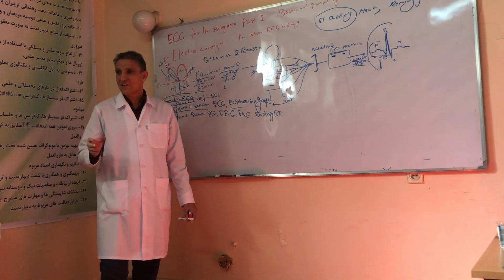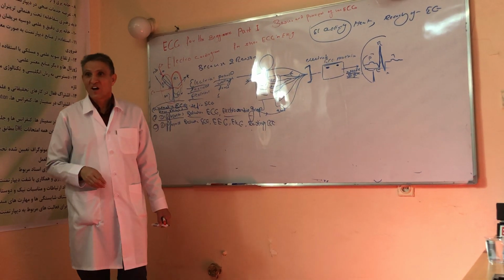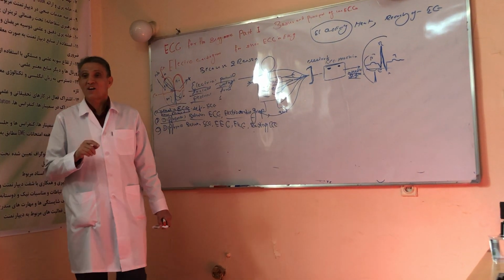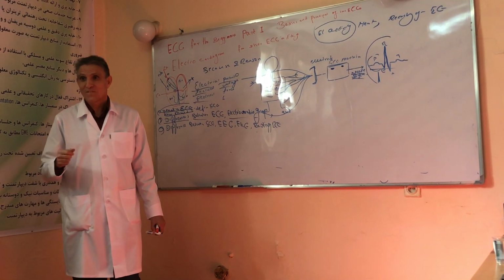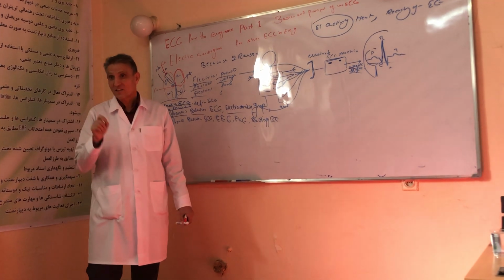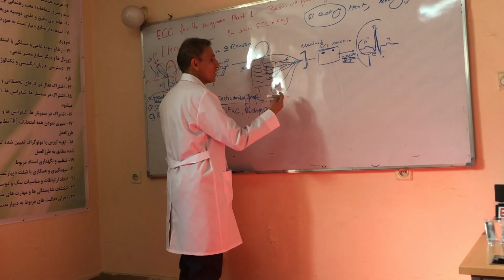A resting form of recording of electrical activity of the heart, the simple form, is resting ECG, or those ECGs that we take every day in our clinical practice. That is called resting ECG. And after resting ECG, we have another ECG by the name of ETT, exercise tolerance test, exercise ECG testing, and TMT, or treadmill test. This is also a form of the ECG.